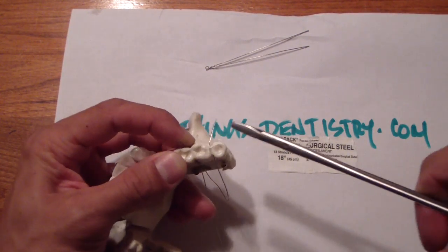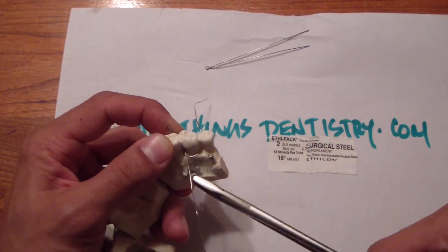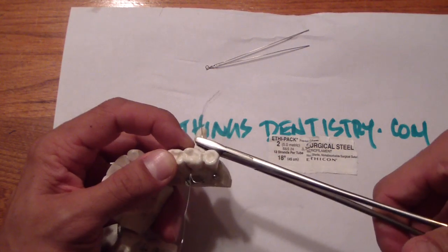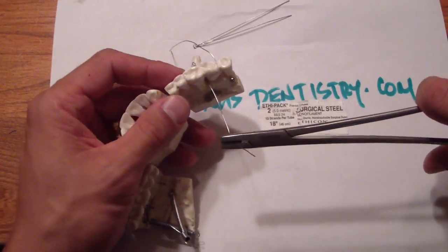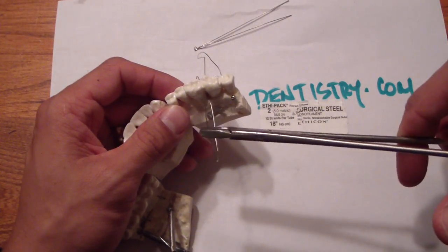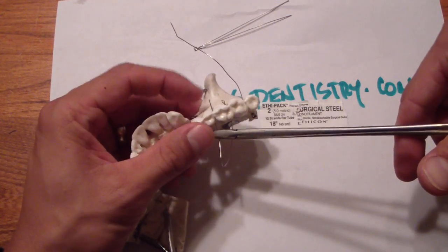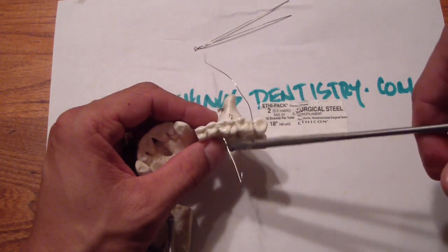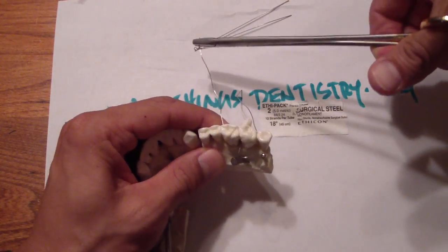Underneath the contact, it's going to come like this, and you pull through. And again, that's easy on the model, not easy intra-orally. The wire can't be bent — it has to be fairly straight or it's just not going to go. As you come more forward, it's best to maneuver it, get it ready, and then pull it forward. Get the other person to grab it with their Hagar's and pull through.